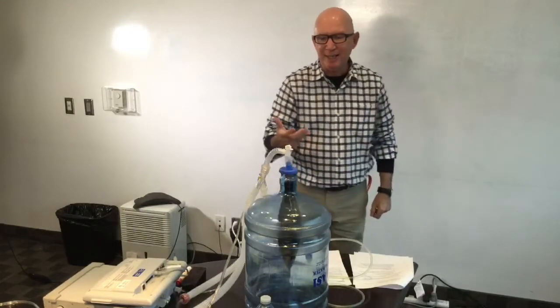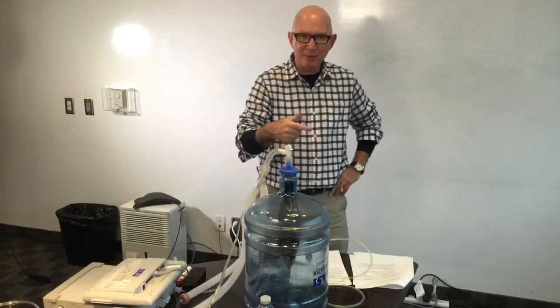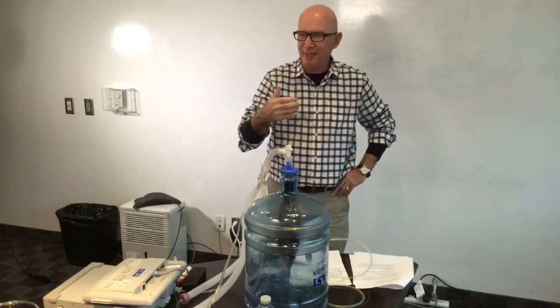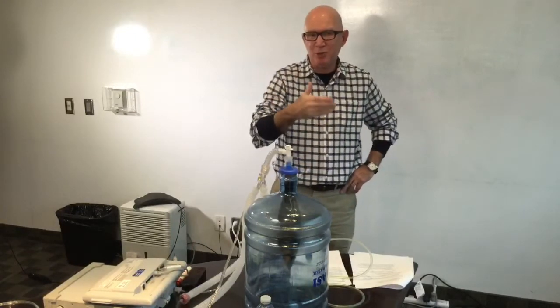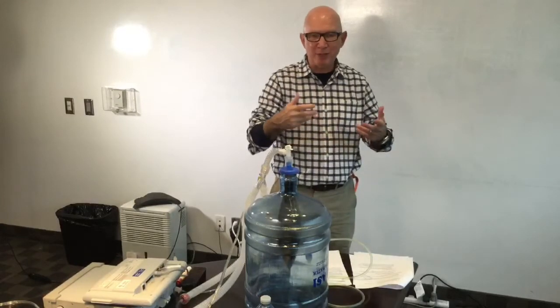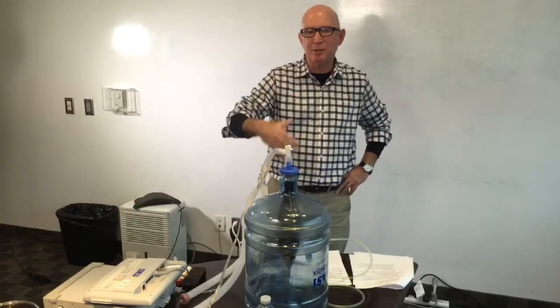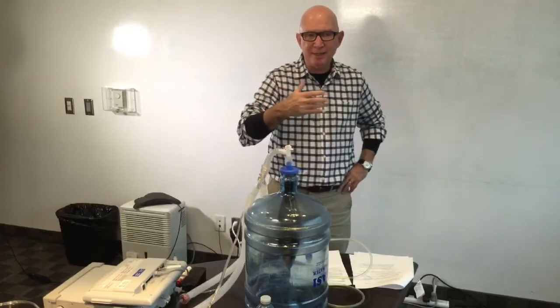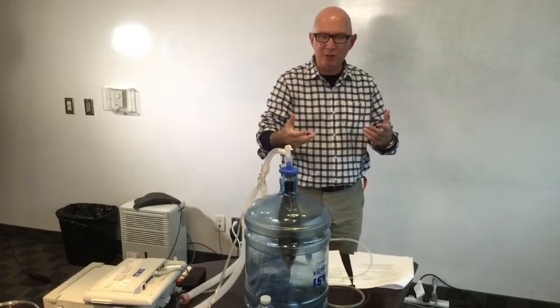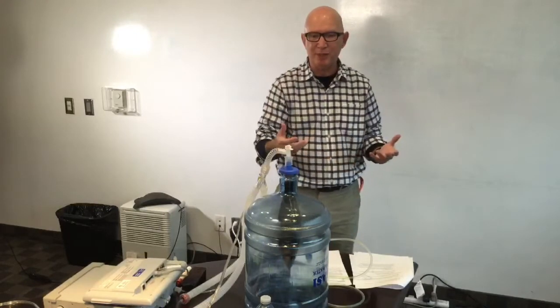That's what you need. Now, having said that, we do go to a permissive hypercapnic strategy by dropping our tidal volumes from 6 to 8 mils per kilogram ideal weight to 4 to 6 mils per kilogram. And so when you drop it to 4 to 6, the smaller volume that you're delivering is going to take less pressure to deliver it. So it still may exceed 30, but it won't be as much pressure as required to deliver 6 to 8. So at the end of the day, we still have to ventilate our patients. And if it takes more pressure to do that, and we've optimized all our other parameters, then that's what it takes.